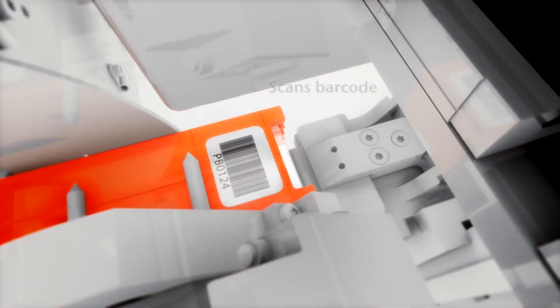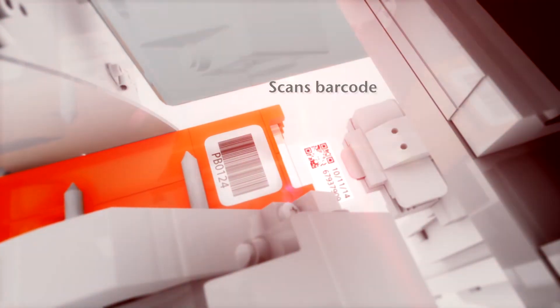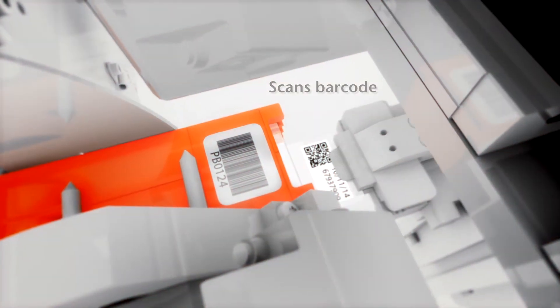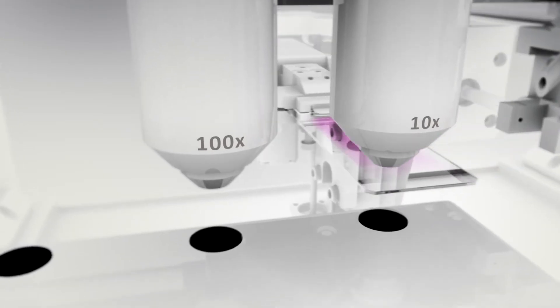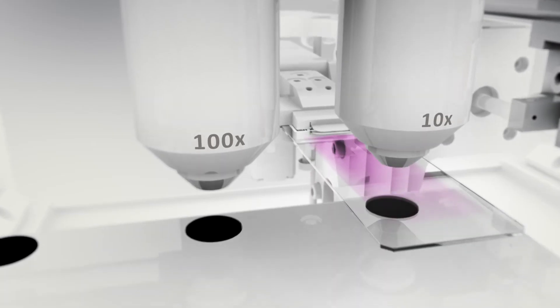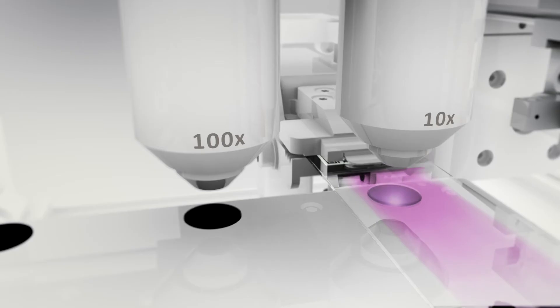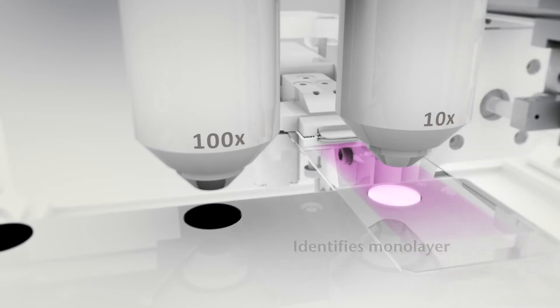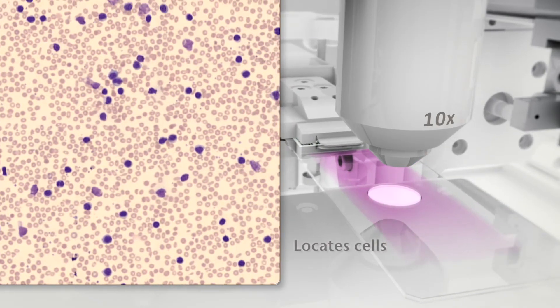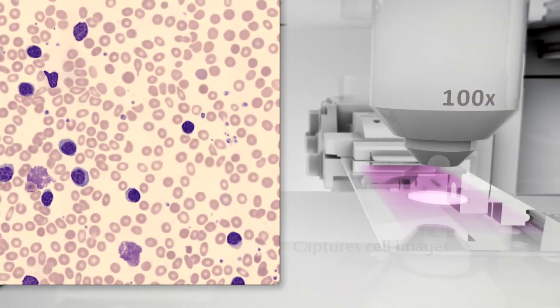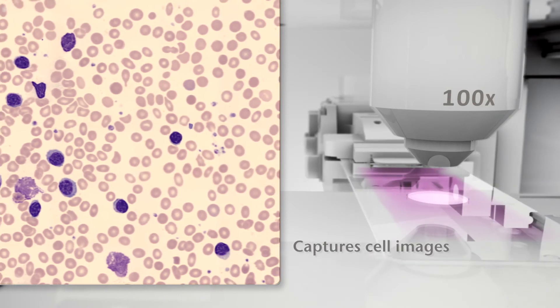The system scans and reads the slide barcode and queries the laboratory information system for patient demographics and order data. The slide is automatically positioned under the microscope, the monolayer is identified, cells are located, and high-quality cell images are captured.